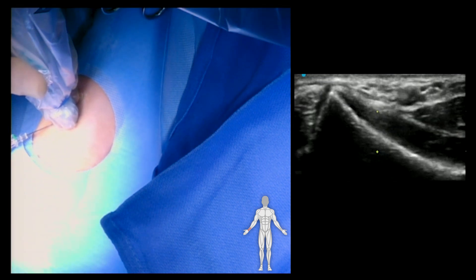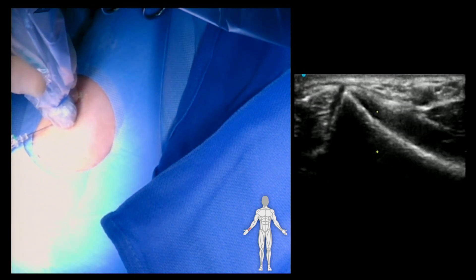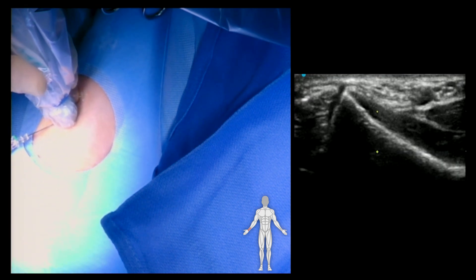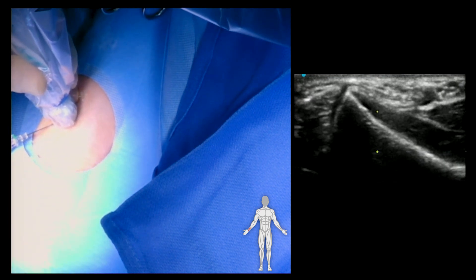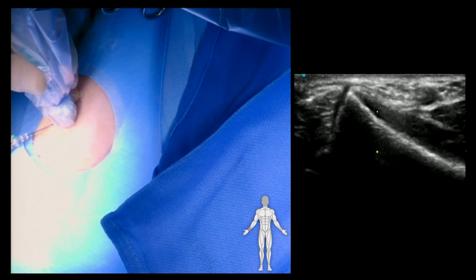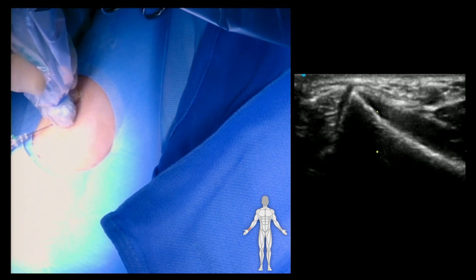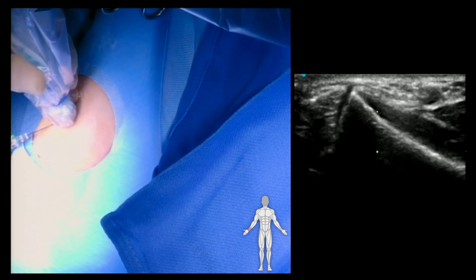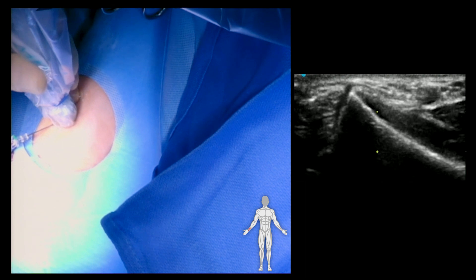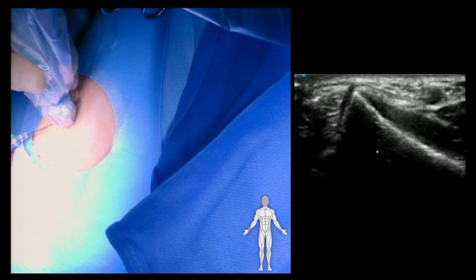You can see the needle with blood return inside the radial artery. Then you put in a micropuncture wire and size up to take the skinny sheath. In this case we see a 6 French sheath placed inside the radial artery.